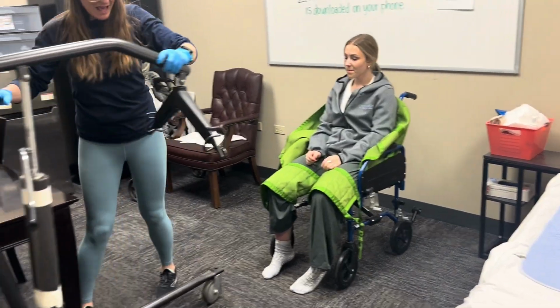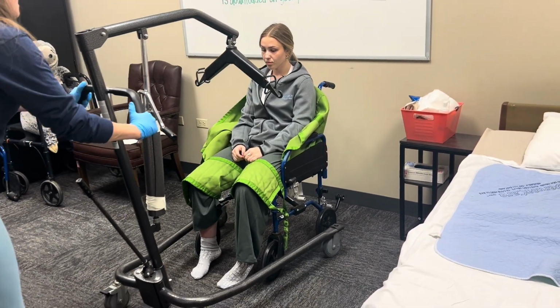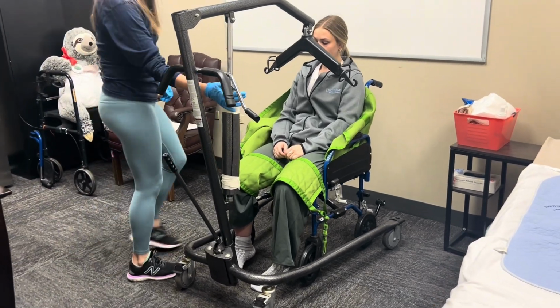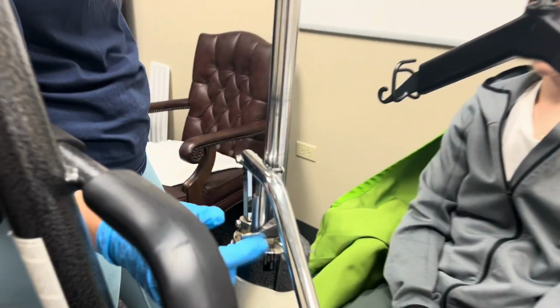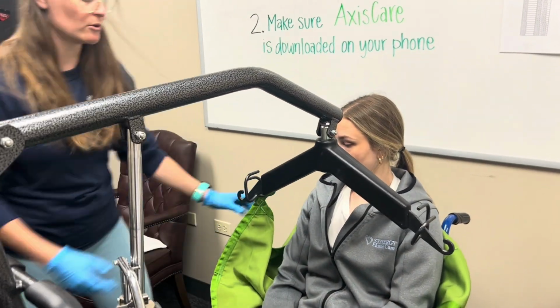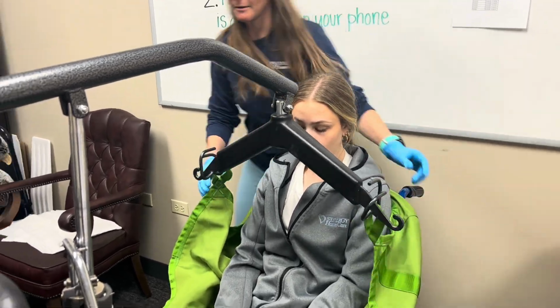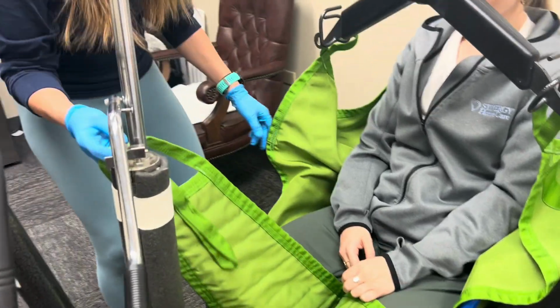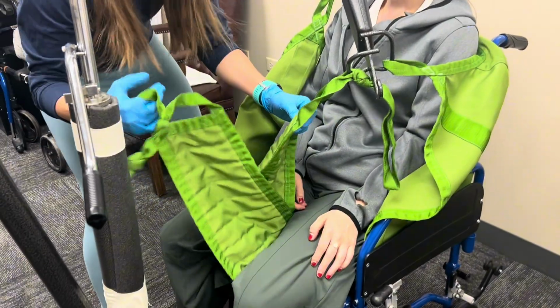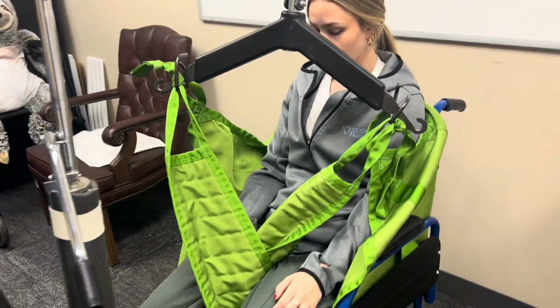Okay, Miss Michaela, we are getting out of that chair. So I am moving. I want to make sure the legs are wide enough, and I want to get nice and close. I'm going to lock the brakes. Most important thing, I want to make sure that my Hoyer lift is locked and engaged and ready to hold you. My upper straps, one upper loop, one upper loop on the same side. This strap was on her right leg, so it's going to go onto the left side. This strap is on her left leg. It is going to go on the right strap. We have crisscross applesauce. We are ready to rock.